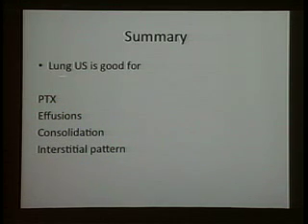So again, ultrasound is going to be good for pneumothorax and effusions. I think you can see consolidation or pulmonary edema, and I think this interstitial pattern can be very interesting. When you're starting to get a little bit more sophisticated with the use of the ultrasound, you can tell even volume status or amount of fluid in the lung based on the pattern that you're seeing on your B lines.